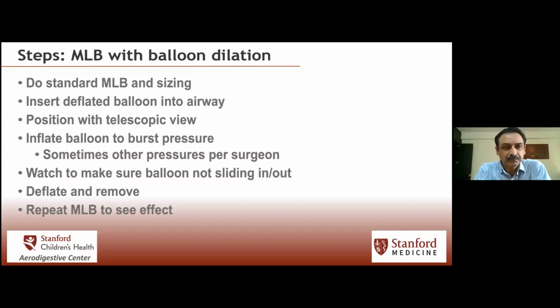And classically, with the older style of Clarent balloons, people would just hold on to the balloon and it would put tension on that inner lumen. That would actually create a situation where when you go to deflate the balloon, it doesn't deflate. And we can talk about that in a moment.